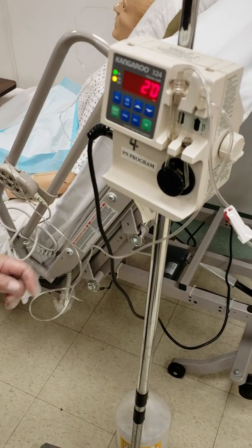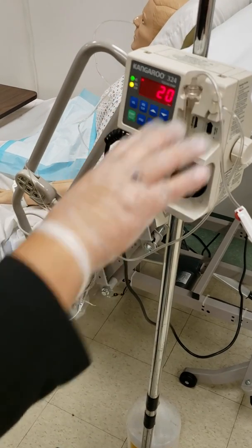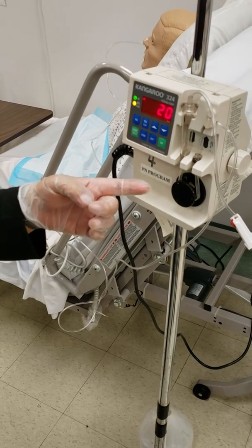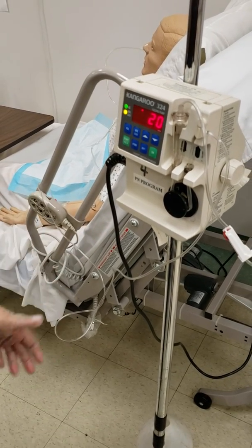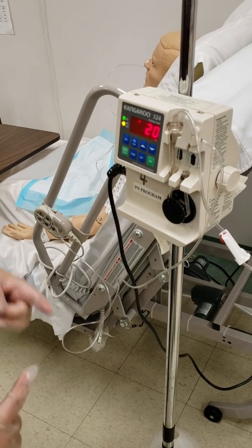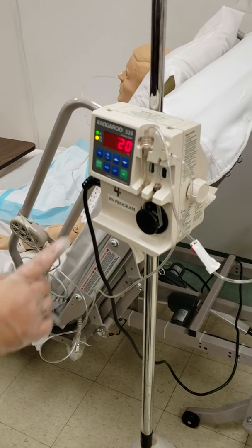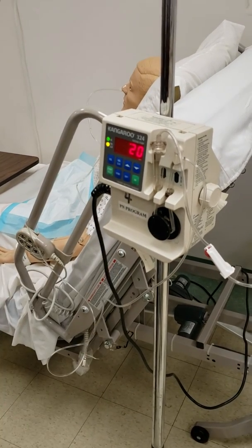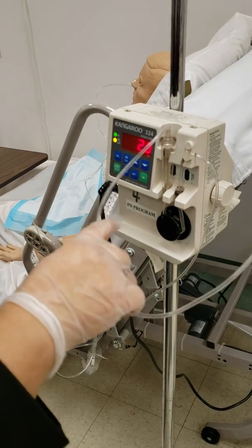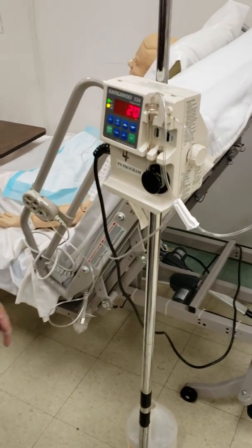And this you start. It's gonna alarm because there's nothing in there. All right. So basically, it's gonna stop because it's only 20 ml per hour, so it's a very little amount. And then it's gonna start all over again. It's gonna move. And also this one has to be open. It'll alarm.